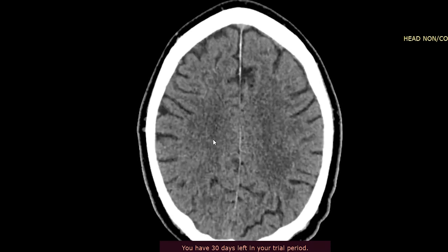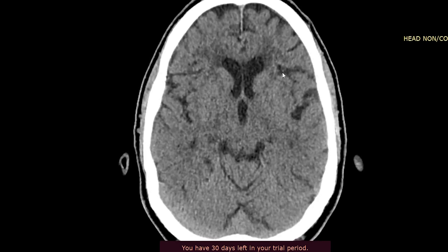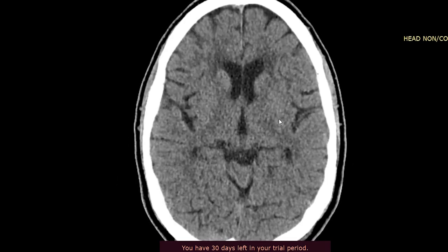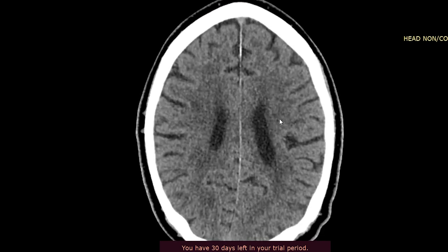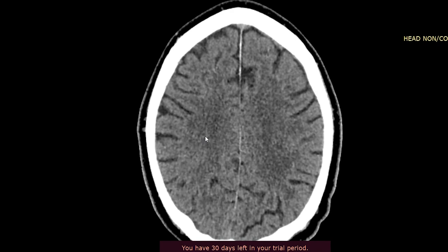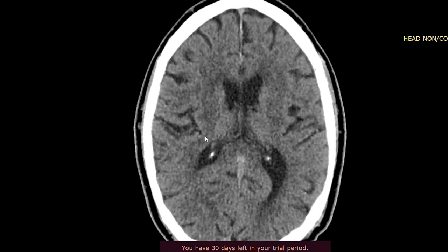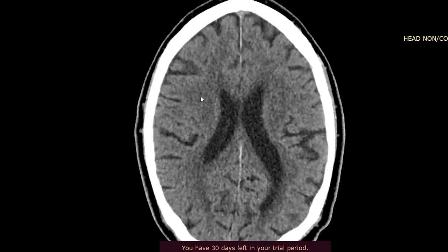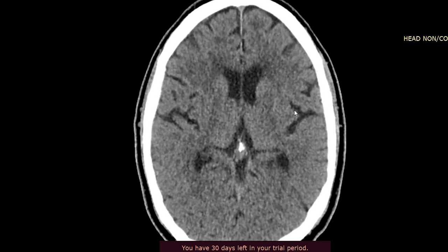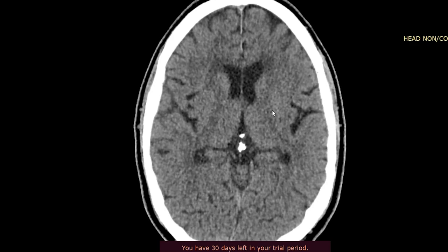Then you want to move on to the gray and white matter interface and see what that looks like. This is an older patient, so we can see there's low attenuation within the periventricular white matter, which likely reflects chronic small vessel ischemic change. The main thing to make sure is that there is preservation of the gray and white matter interface, because subtle loss of that can suggest early ischemia.